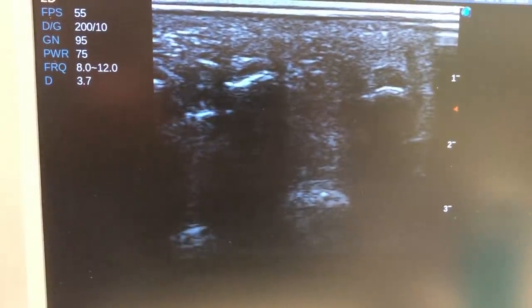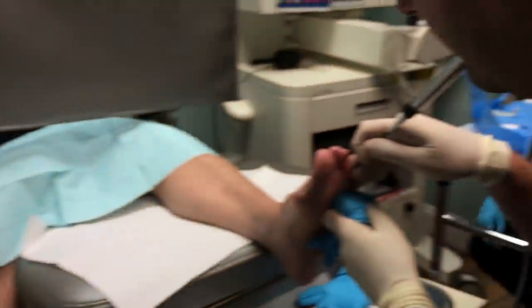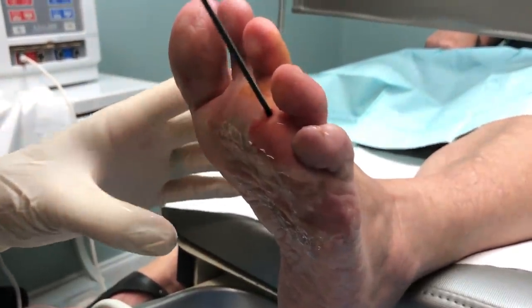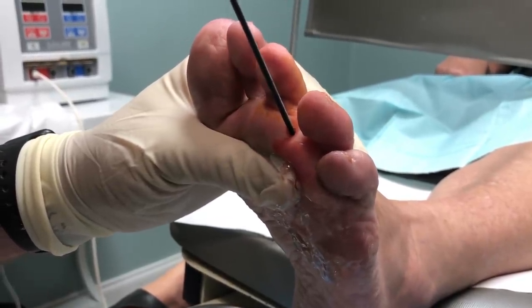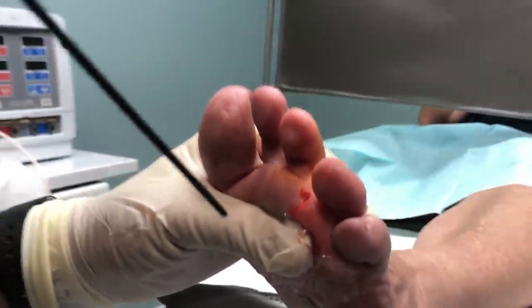Now we do two two-minute freezing cycles, which we'll start here in a second. Now it's all done. You can actually see some of the ice here on the probe — it's pretty much frozen in her foot, which is good because that means the ice ball hit right where we wanted. We give it a little wiggle and it slides right out.